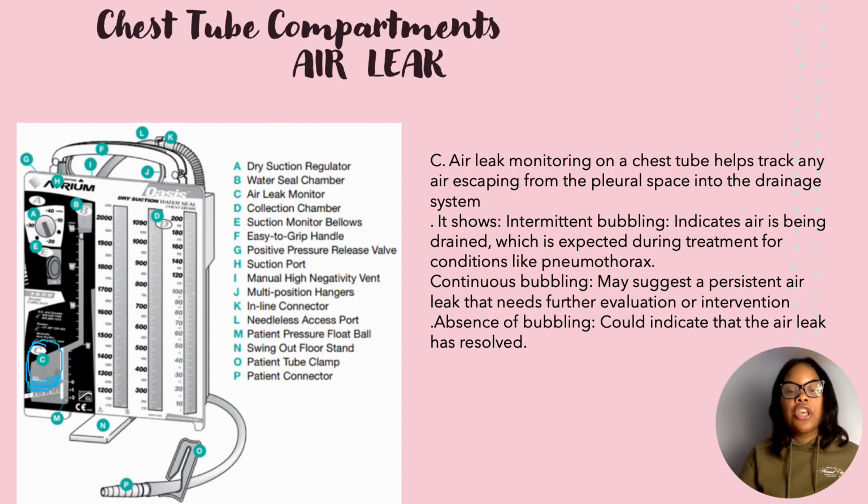But if you see continuous, vigorous bubbling, that may suggest that this patient has an air leak, and we would need to do some further treatment.